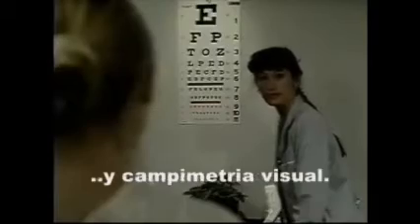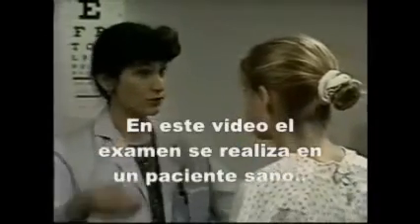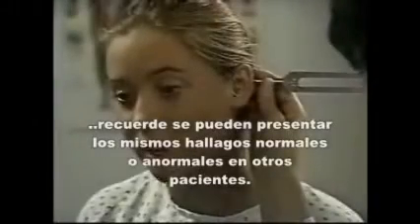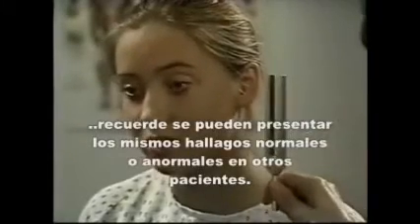Examination of the eyes includes tests for visual acuity and visual fields, inspection of the eyes, and ophthalmoscopic examination. In this video, the examiner will assess a healthy patient. Keep in mind that other patients may have the same normal findings or may exhibit normal variations or abnormal findings.